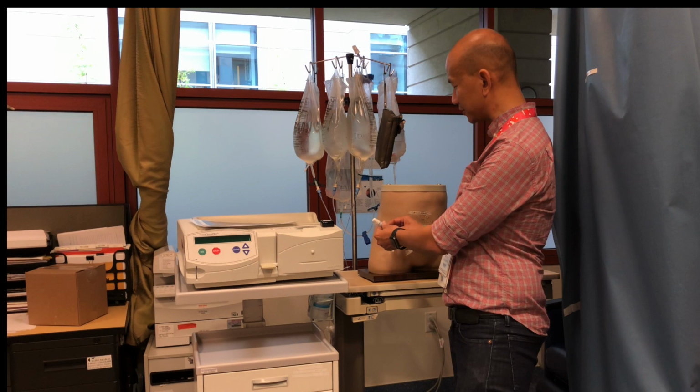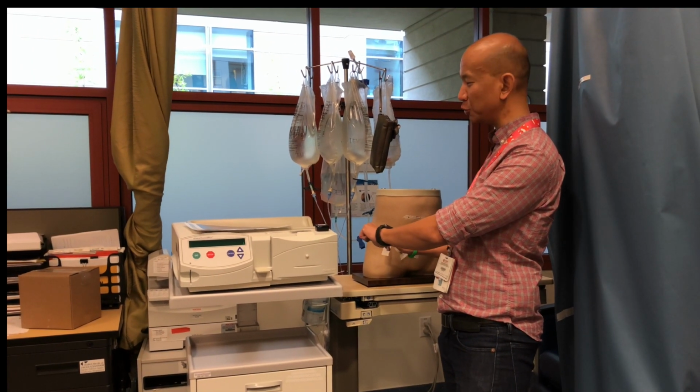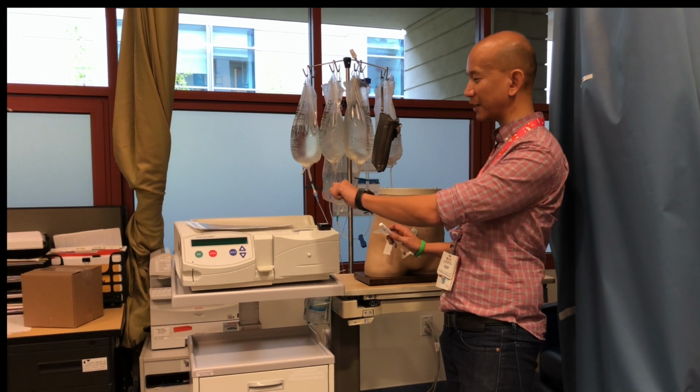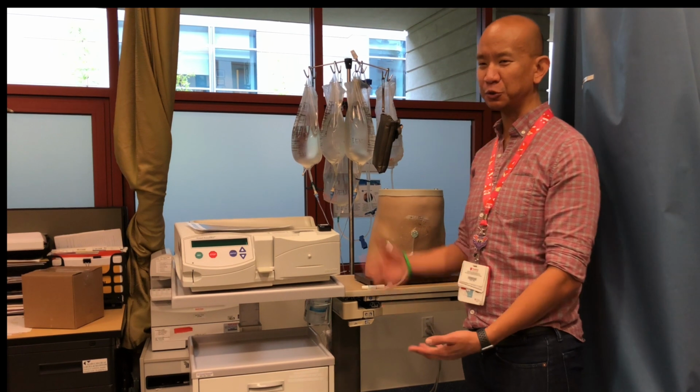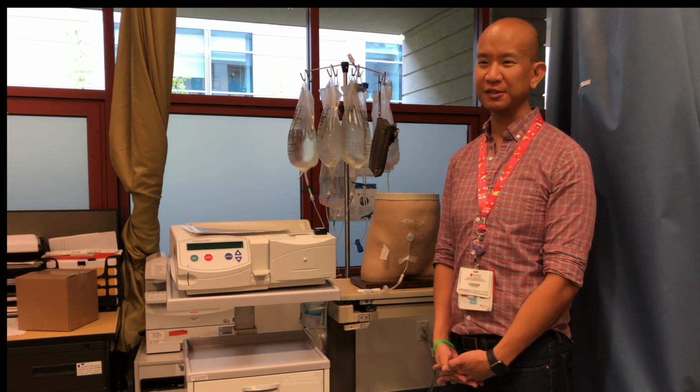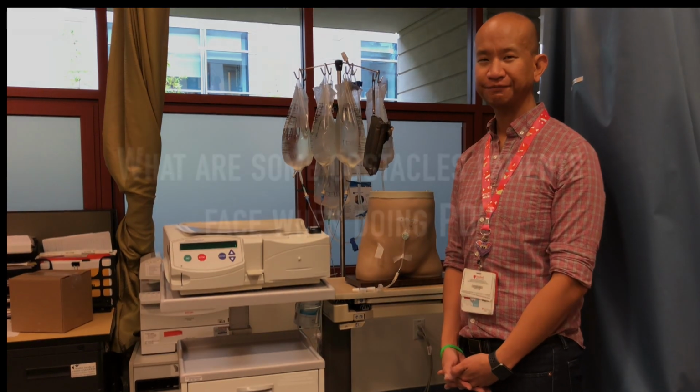So the dialysis catheter can be opened up and connected to the tubing that then connects to the dialysis solution. And then at that point, the cycler machine is able to run the automated peritoneal dialysis over the course of usually 8 to 10 hours overnight.